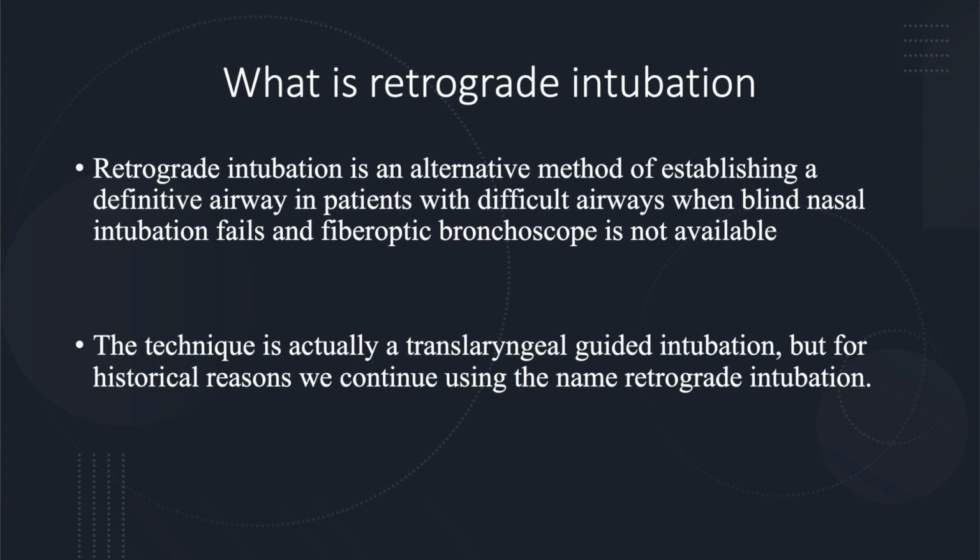It is a technique that is actually a translaryngeal guided intubation, but for historical reasons, the person who created this modern method of intubation described it as a retrograde intubation. So we continue to call it a retrograde intubation because that's what he decided it should be named.